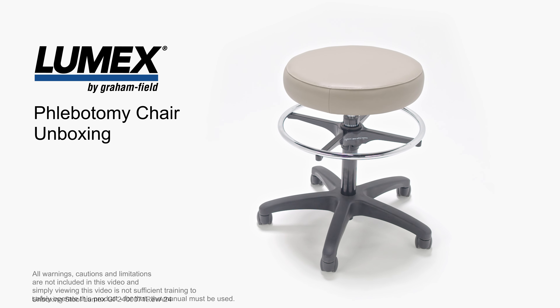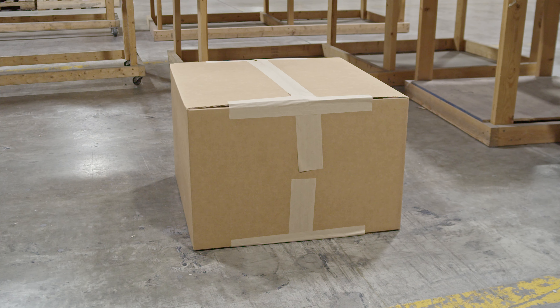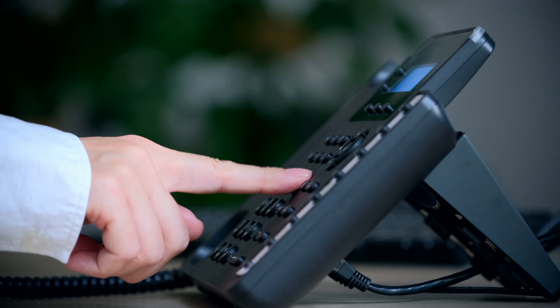Lumex Physician Stools come with options such as a foot ring and backs. When the box arrives, check for any obvious damage to the carton. If damage is evident, notify the carrier and Graham-Field.